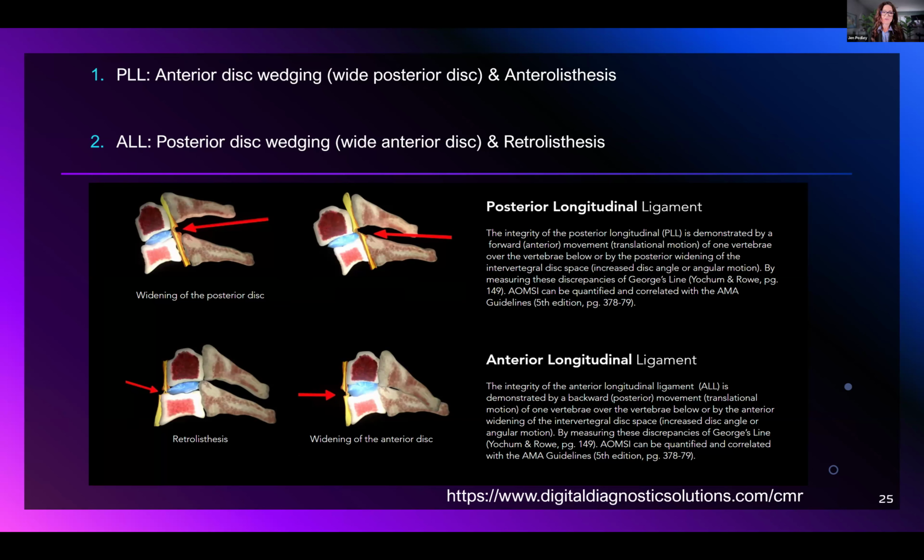Yes, absolutely. And I like this too, particularly for attorneys, because they may not know the anatomy. Some of them might be fresh into PI and not know what the anatomy looks like. And when we're talking about certain things on the x-rays, this is showing ligamentous injury, even though we cannot actually see the ligament on the x-ray. That is the comment I get, as I mentioned earlier, about the MRI. You would think it would show tearing of the ALL and PLL or some of these other fine ligaments, but it just can't.